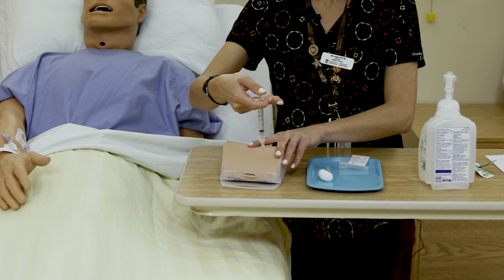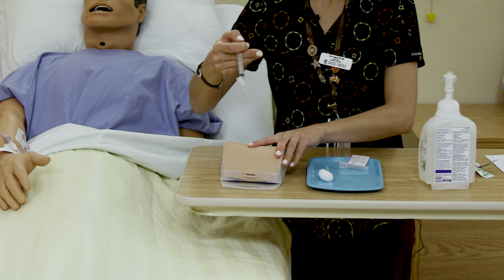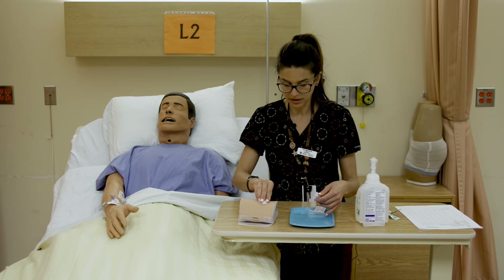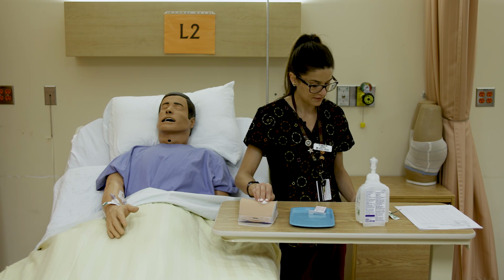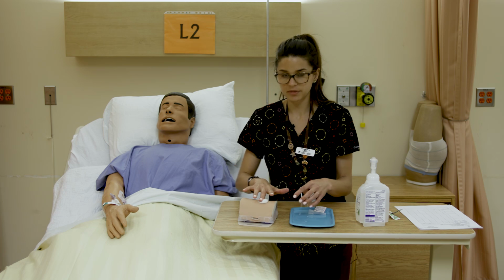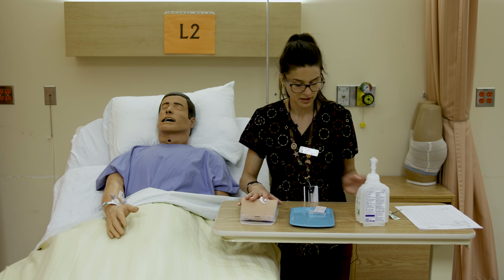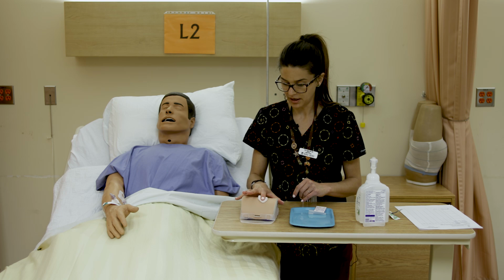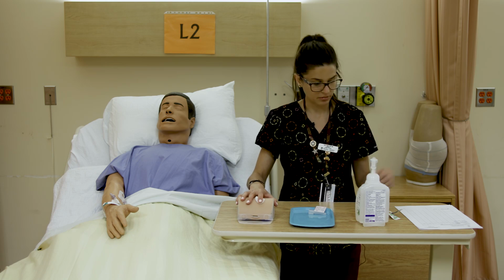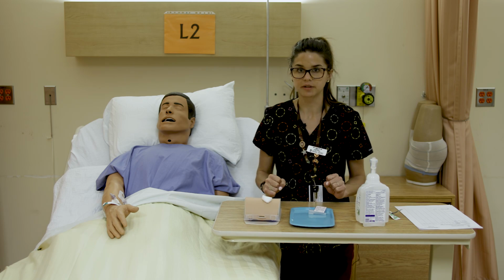Maintaining that pull, we're now going to remove the needle, and then you can let go of the tension on the skin. We'll want to cover the person, activate our safety, and discard the needle into the sharps. Again, we're not going to massage the site. We're just going to apply some gentle pressure if it's bleeding. Maybe a Band-Aid is indicated. We'll make sure the person is comfortable, and then we're going to document, sign our MAR, and discard and clean up our supplies.